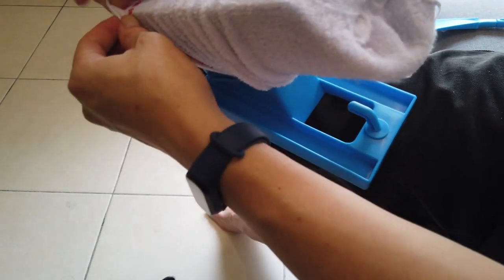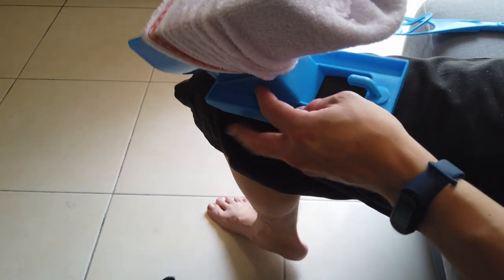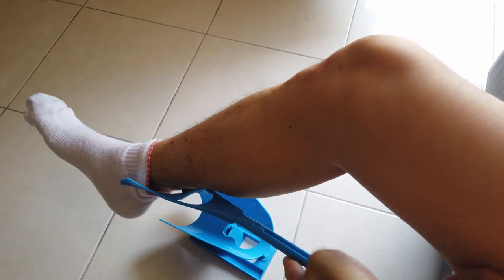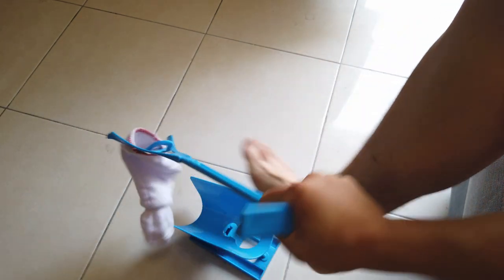And then when it's ready, use the handle to place it down and just slide your leg all the way in like this. Last but not least, you can also use the handle to help you to remove the socks.